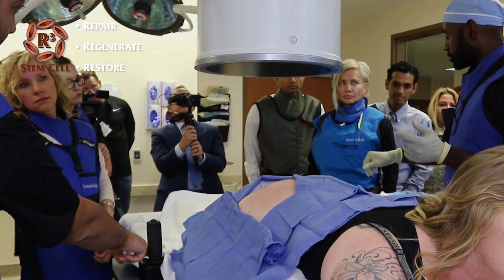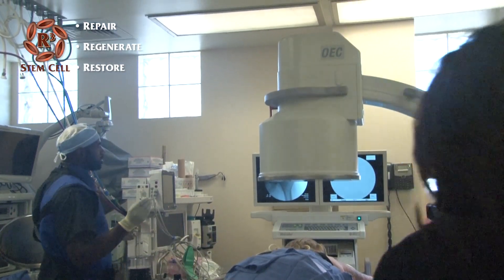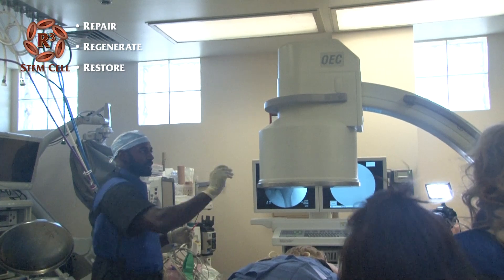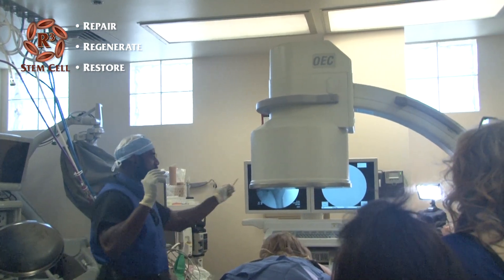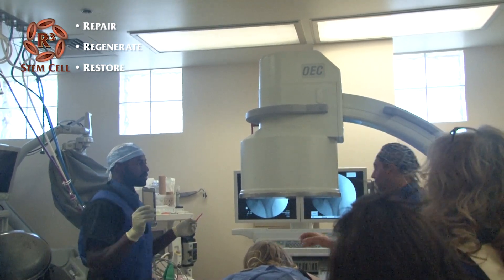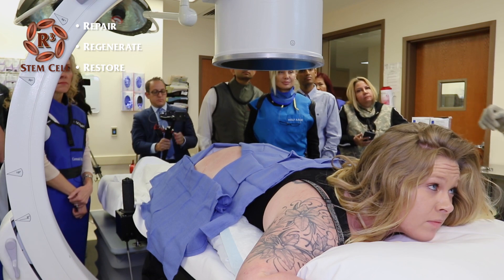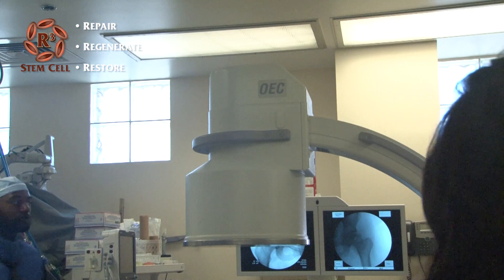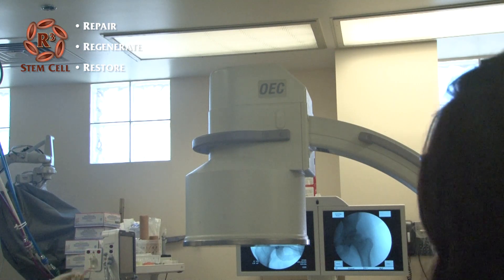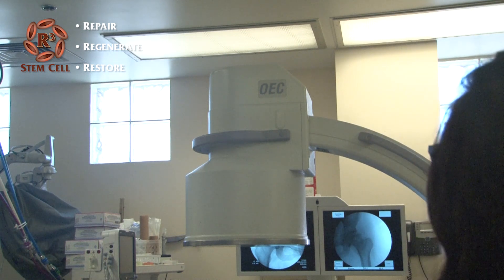You can see already, just by looking at the joint — can you take a picture of that, and then take a picture of her left hip joint so we can do a quick comparison of both joints? Can you guys see the difference? You can tell that something is just not right with the one on the right side, because it just doesn't look as clean as the one on the left side.